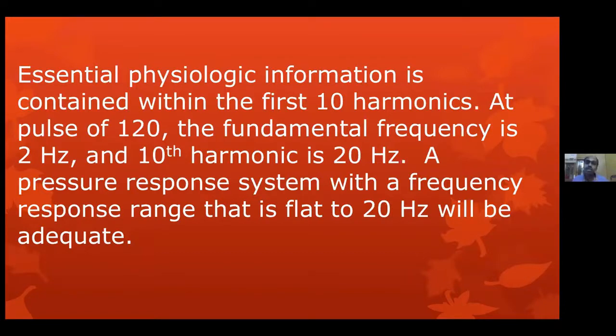But the same patient, when he goes in for a percutaneous transcatheter aortic valve replacement, you have recorded a mean gradient of 40 millimeters and you take him into the cath lab and record the pressure. Sometimes the peak to peak gradient may be 35 millimeters of mercury, especially if the aorta is very small.